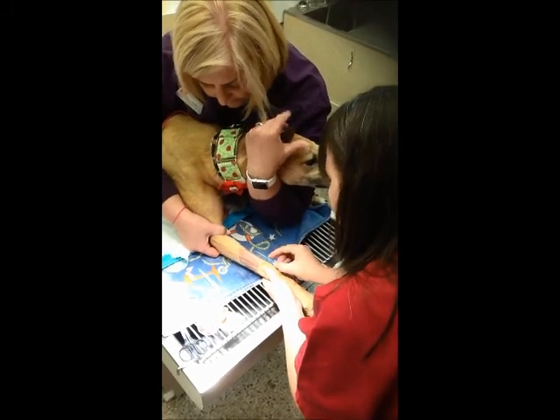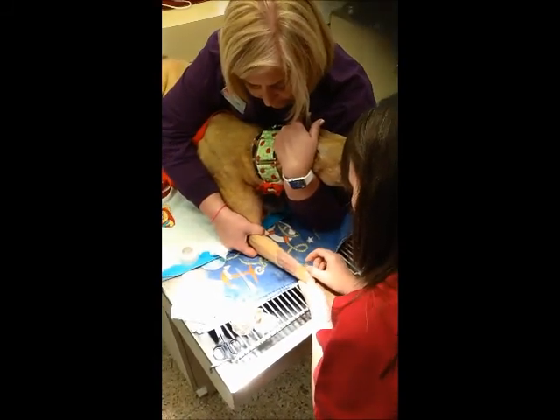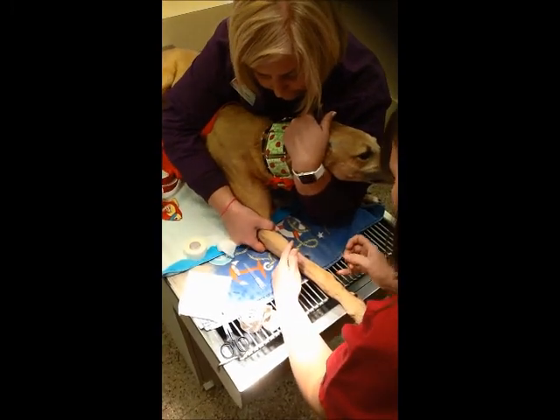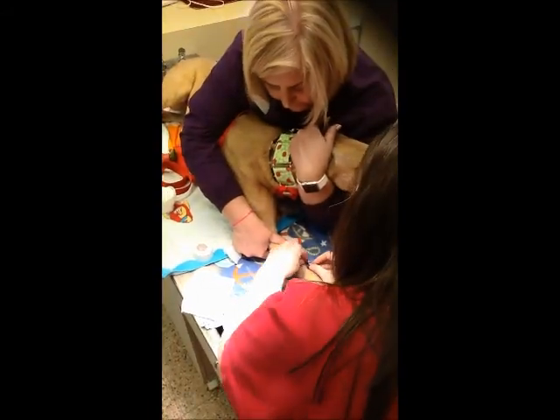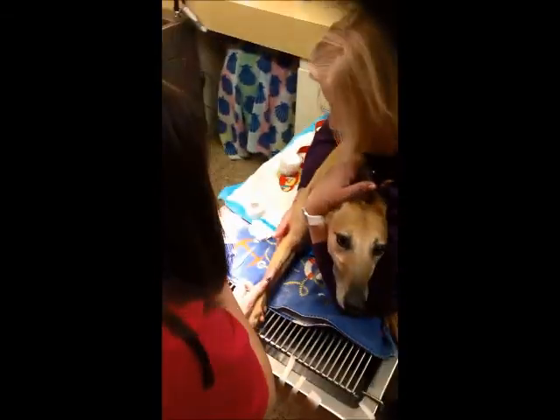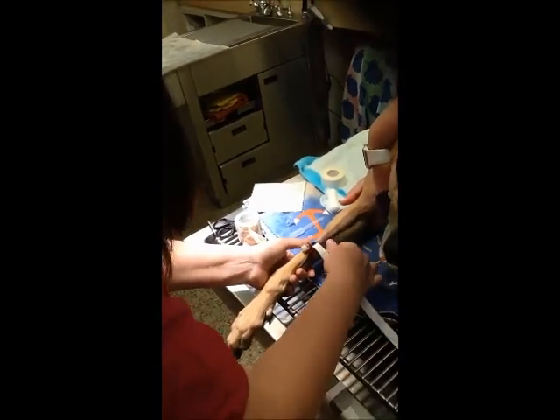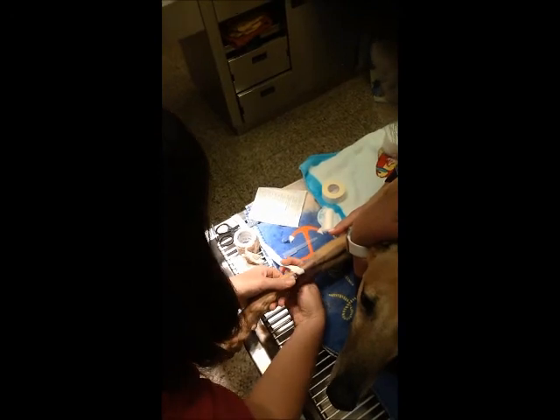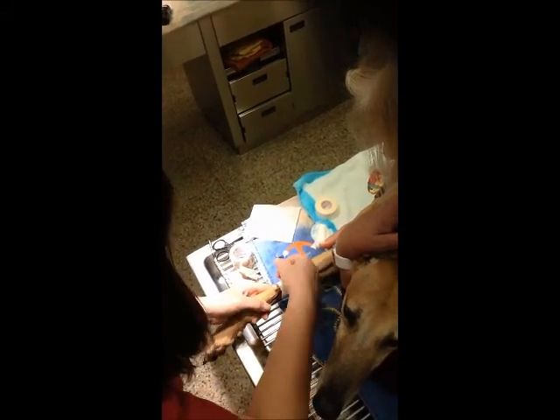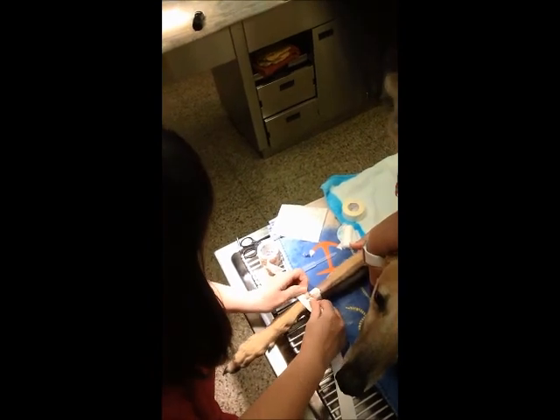Good girl. The first piece of tape is going to go tape side up, sticky side up, and around the hub. The larger piece of 1-inch tape is going to go under, sticky side down.